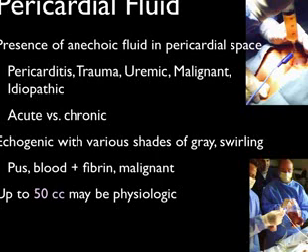We see both acute and chronic pericardial effusions, knowing full well that in the acute patient, actually anywhere from 80 to 200 cc's, depending on the age of the patient, is enough to cause the fluid in the pericardial space to be greater than the ability of the ventricle to fill. In other words, that's called pericardial tamponade, that the heart can no longer expand in the sac of fluid and the patient can die. Now, chronically, you can see huge pericardial effusions.